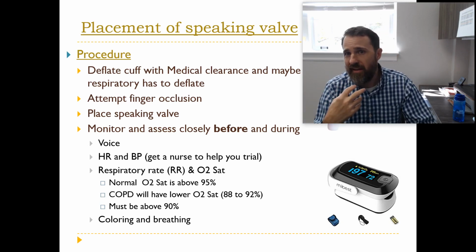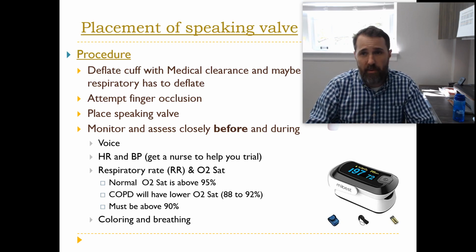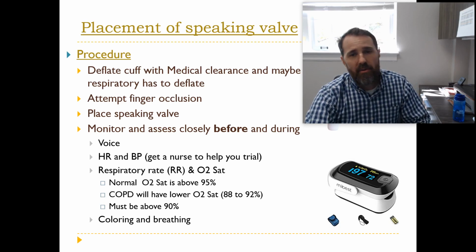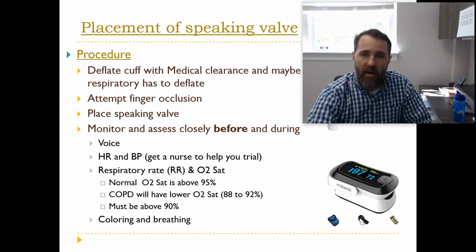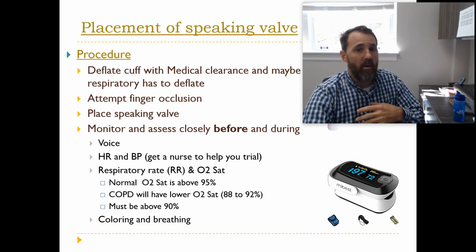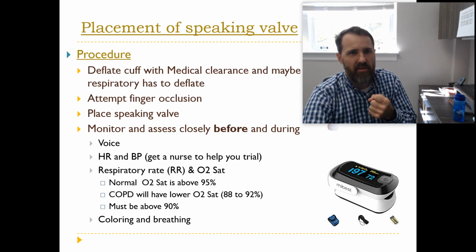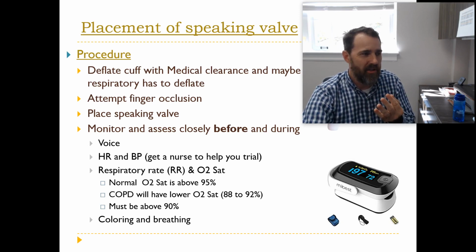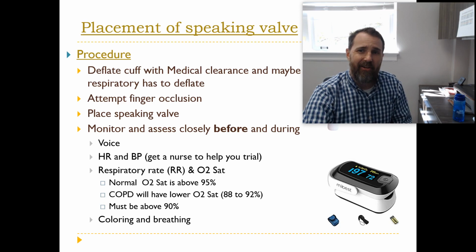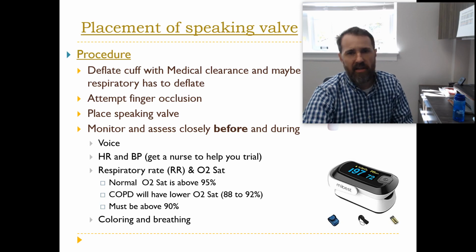And also anything that falls into the airway and, like I said earlier, causes a respiratory crisis, you want that nurse there. So you get the cuff deflated. What that does is it opens up the possibility of inspiratory or expiratory airflow passing through the natural airway around the deflated cuff. And if there's a fenestration in the outer cannula as well, you might want to remove the inner cannula to further facilitate that. And you see how well the patient tolerates that situation.